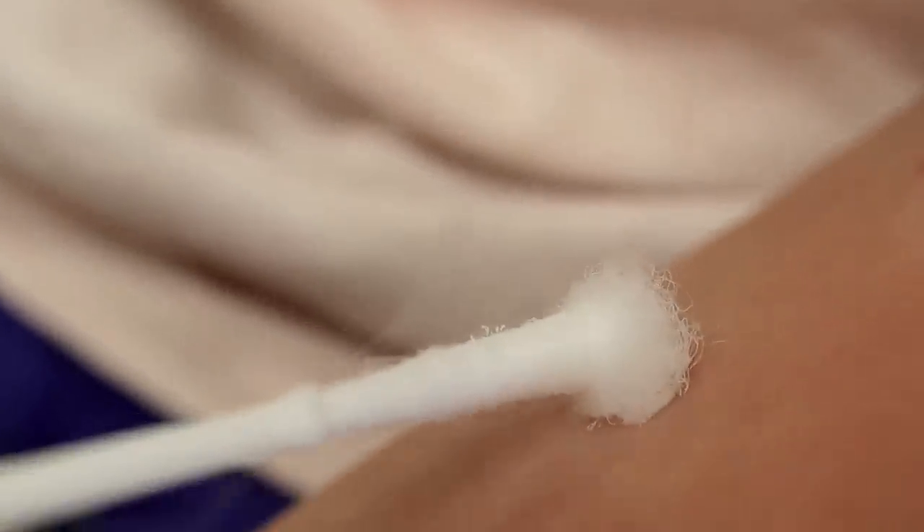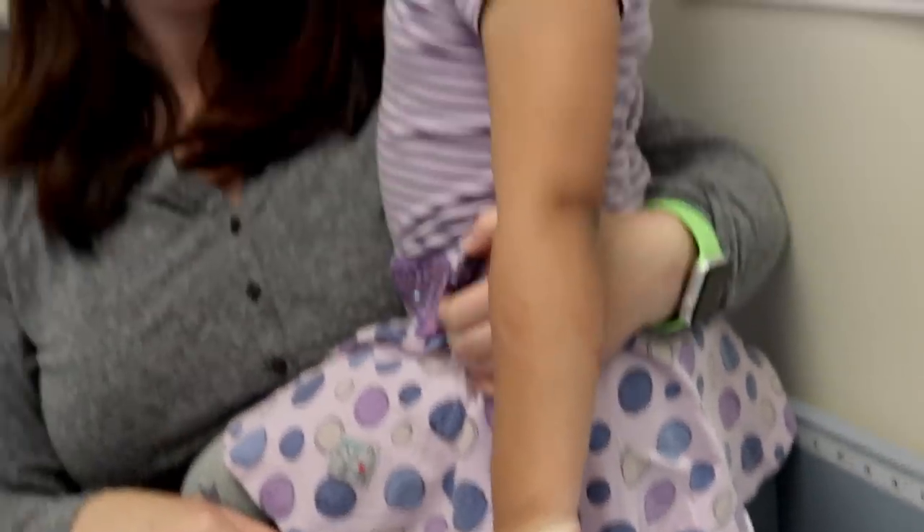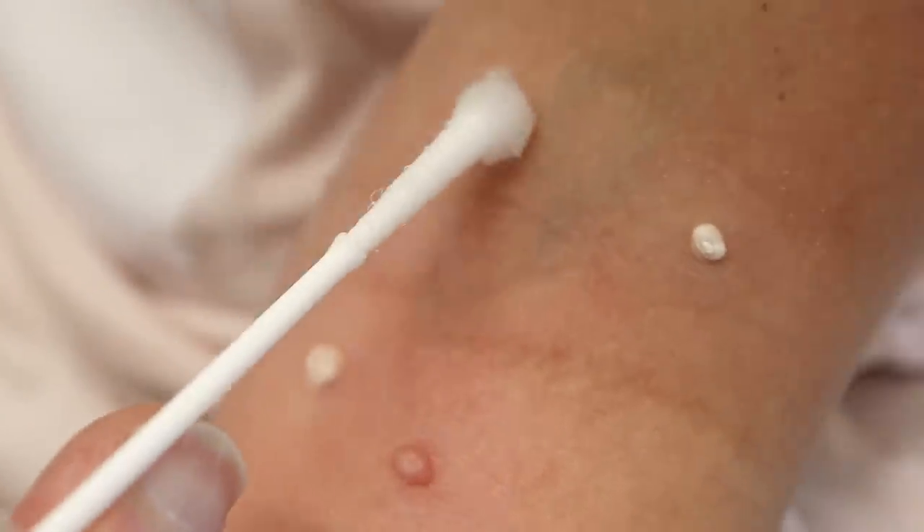You are doing great. Oh mommy, come on. Where I hold. You wanna hold this again? Enough of that one. I'll ride to this one. You're being very brave. Let's get over to this one. That's so cute — hold the hands. Is she squeezing pretty hard? Yeah. If she's squeezing you too hard, then I'll hold.